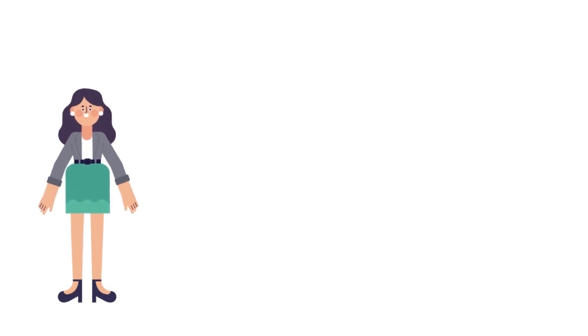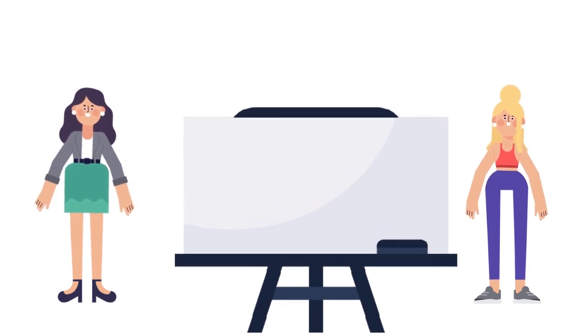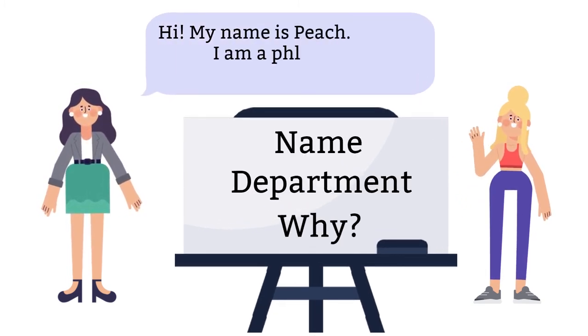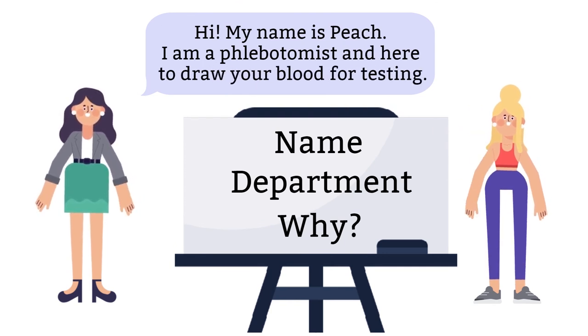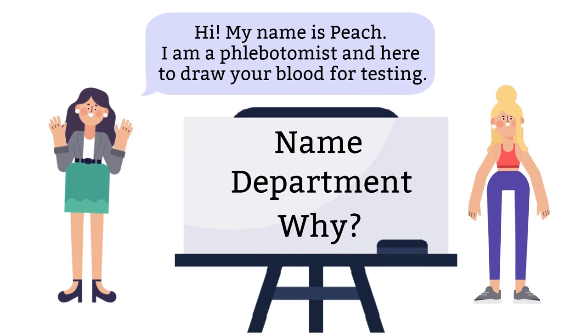The initial process is the same as straight needle collection because you still have to identify yourself, tell the patient who you are, what department you are from, and the reasons you are there. For instance, my name is Peach, I'm a phlebotomist from the laboratory, and I'm here to draw your blood for testing.